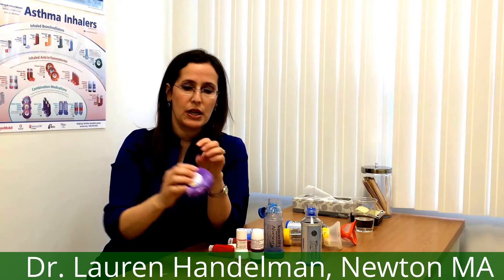One of the advantages of the newer inhalers is that most of them have counters on them. On this one you can see a counter in a little window, and on this one again a little window, and this one has a counter on the side. Some of the puffer inhalers have counters in the back. That way you know when you need to go refill your inhalers. Please let us know if you have any questions and want to review technique in the office — if you're one of our patients, we'll be happy to do that with you anytime.